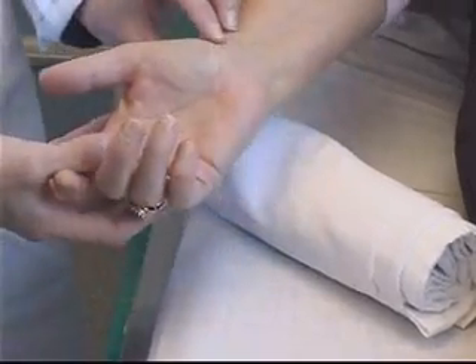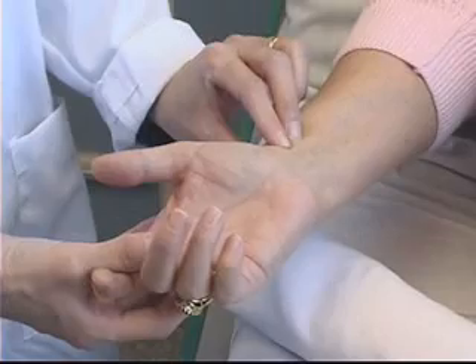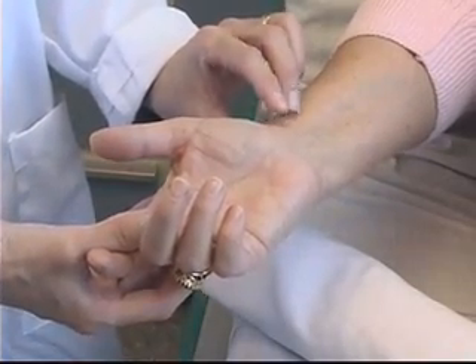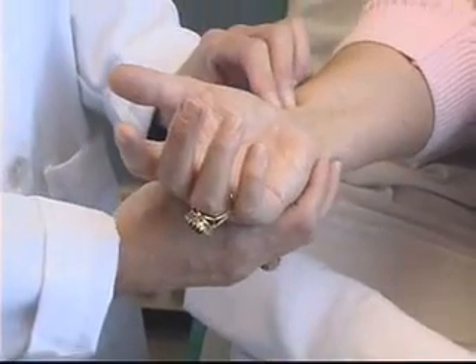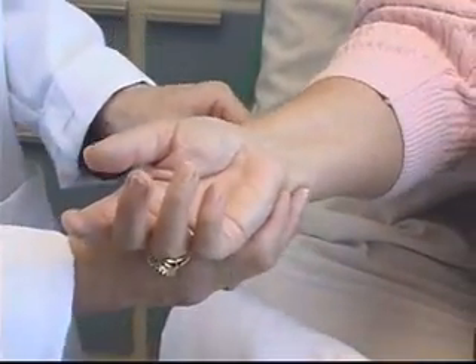We'll begin the procedure by performing the Allen's test. The most common site chosen for blood gas sampling is the radial artery of the non-dominant hand. Once you've chosen the hand, you must first perform an Allen's test, which indicates whether or not there is collateral circulation to the limb.